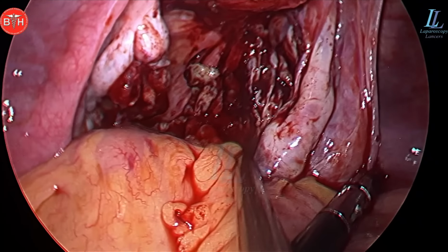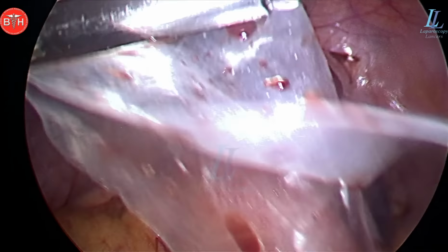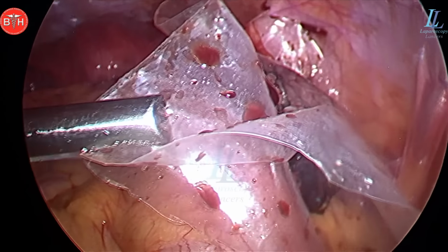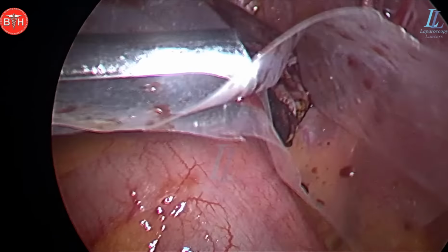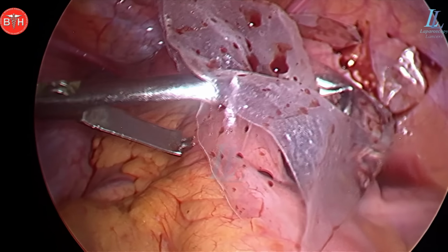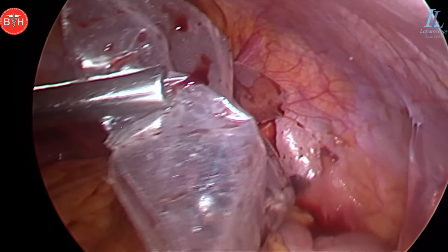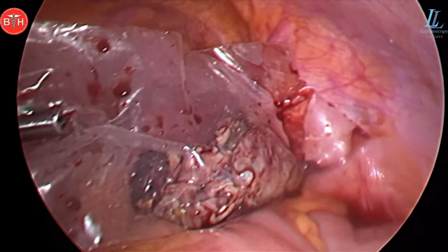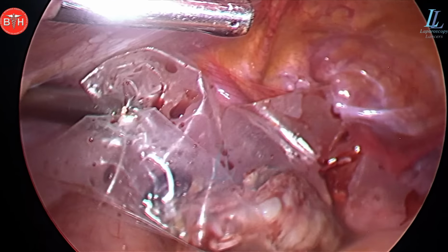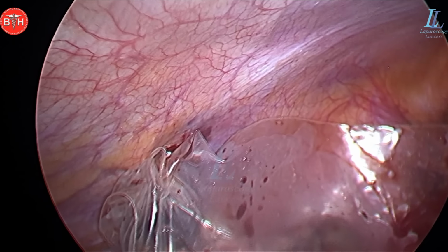That's the most important part of laparoscopic surgery, the dexterity and hand-eye coordination. That is the most important thing, and the instrument coordination. There you can see the gallbladder grasper, the endo bag, and that I have held nicely and pulled it out. I've dilated the incision a bit, and these tissues will come out normally.